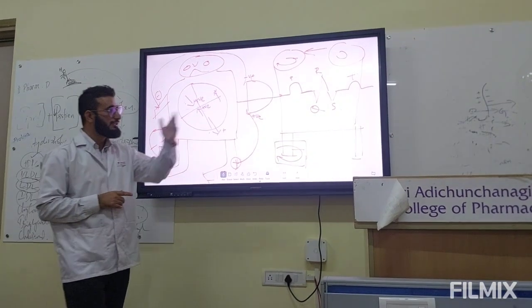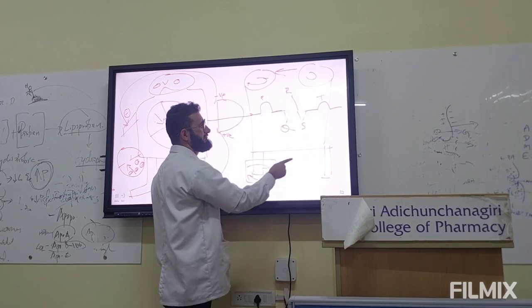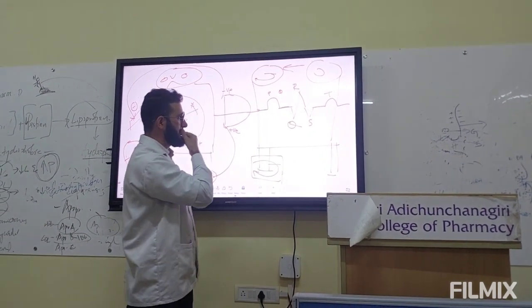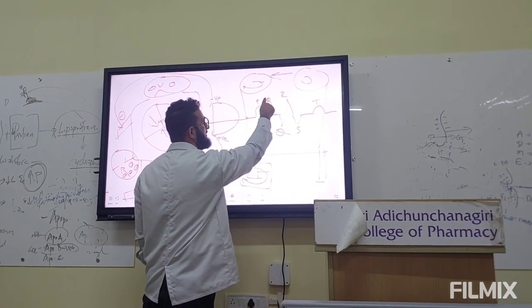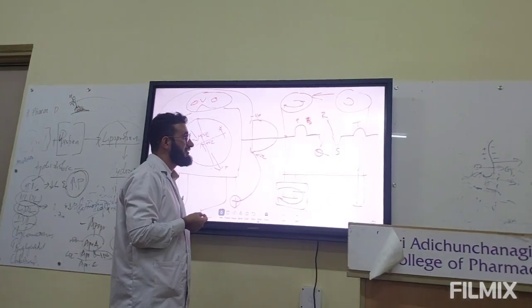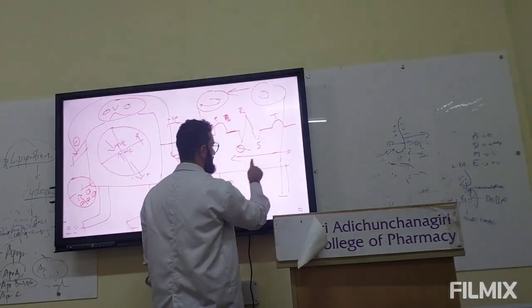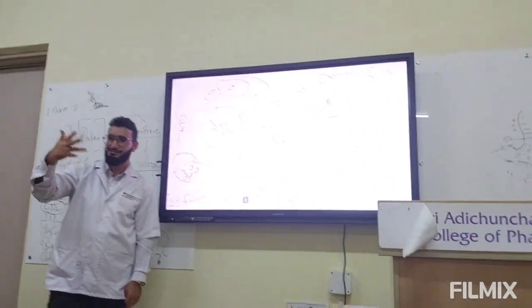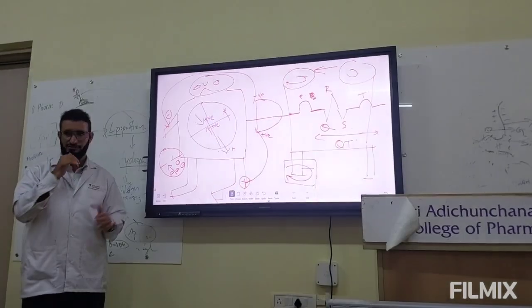Now we have intervals. Which interval is this? PQ interval, actually referred to as the PR interval. Which interval is this? Then QRS, QT interval. These intervals you are going to read in the next station. Till then my job is finished. Thank you.